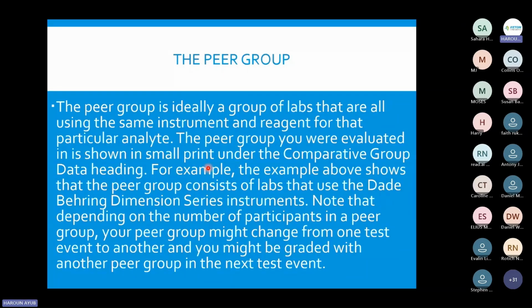So what happens when you get a reagent grouping? You find these particular instruments that are open systems. So you have a Biobase that is using Mindray reagent. You have a Mindray using Mindray reagent. You have a BioSystems using a Mindray reagent. So we are able to group these labs despite their different instruments, because they are using a similar reagent.